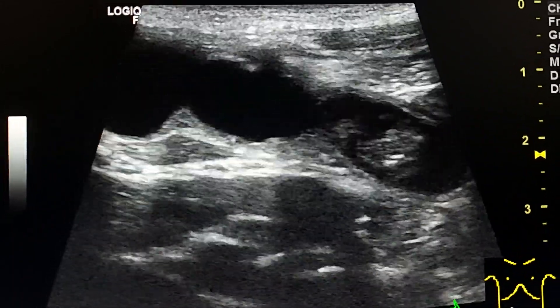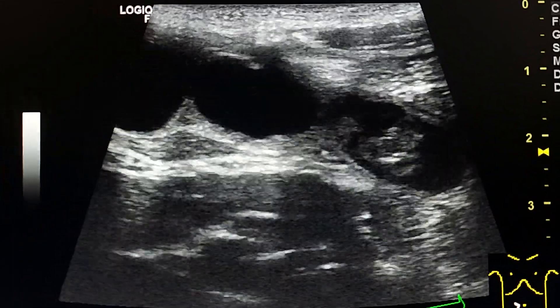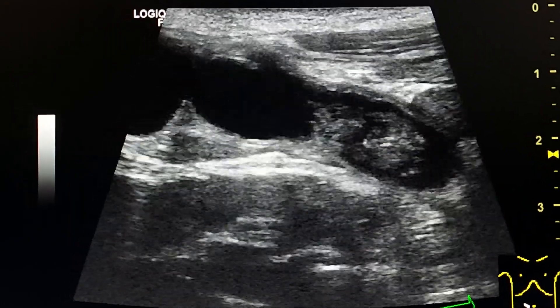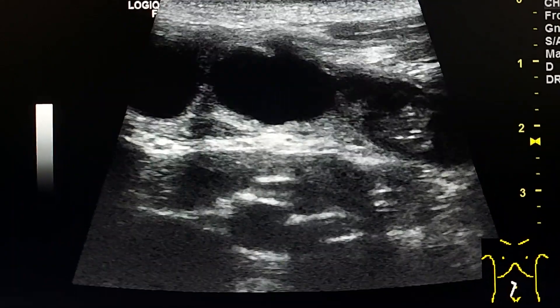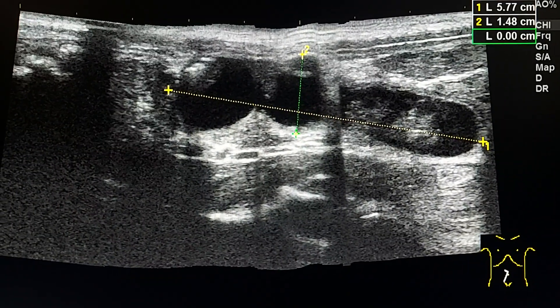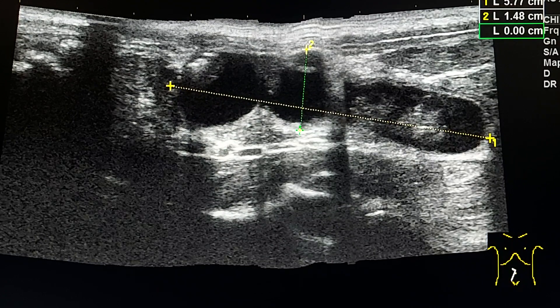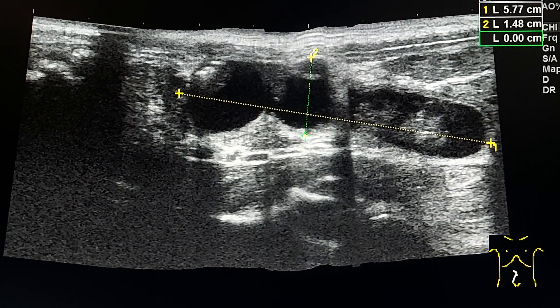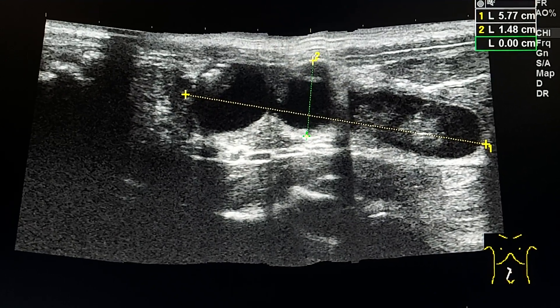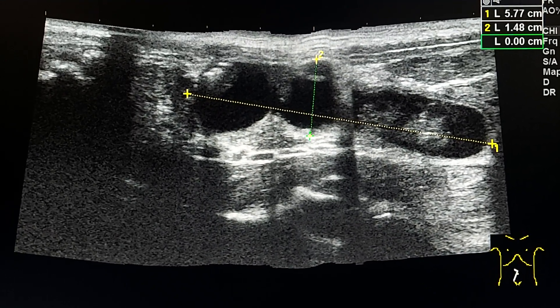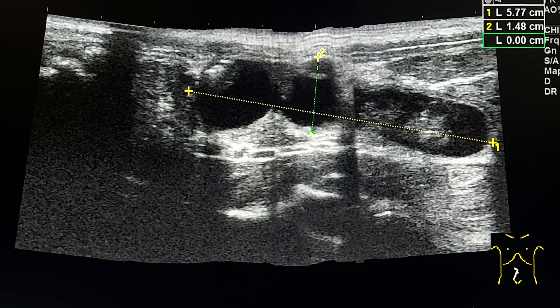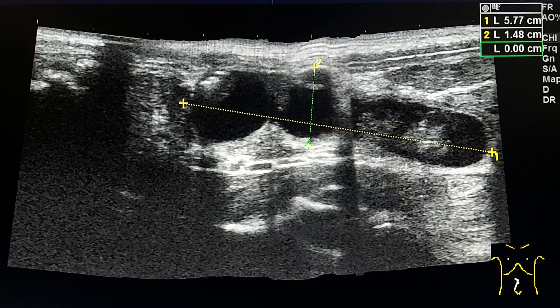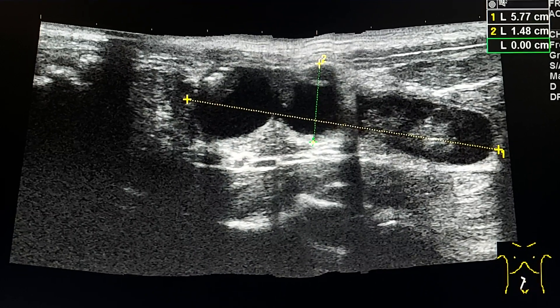It is distended with fluid. This is the panoramic view, showing the length which is about five to six centimeters, and the transverse section with a diameter of about one and a half centimeters.